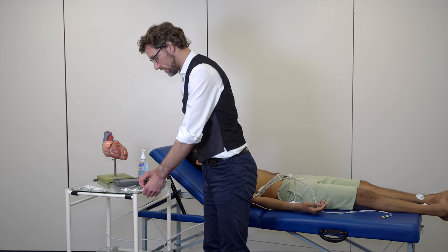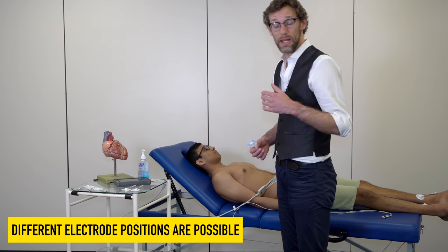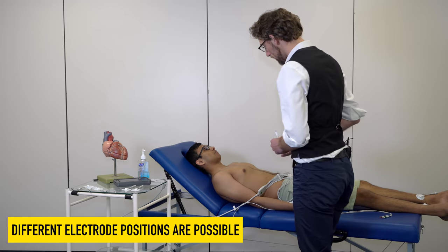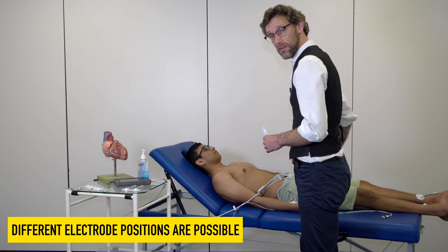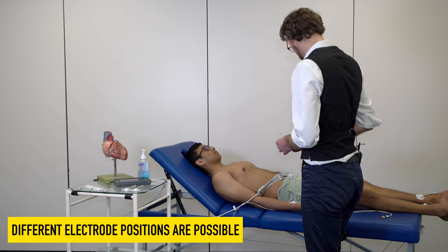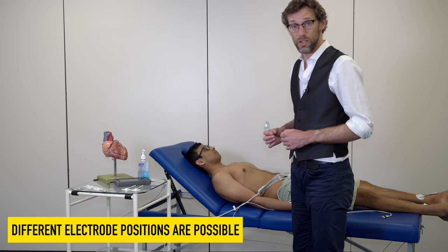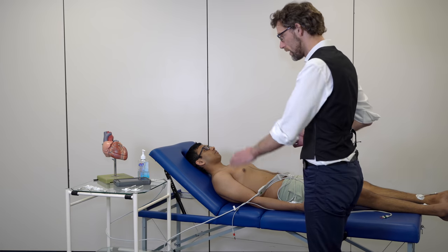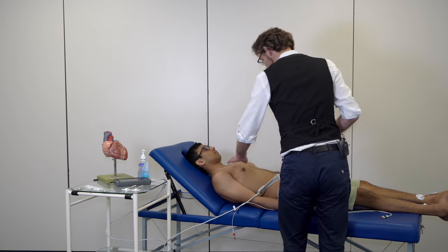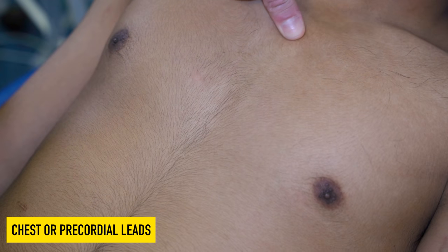You'll see certain ECGs — for example when doing an exercise ECG — where leads are placed on the shoulders and over the mid thighs. This is to reduce the risk of them coming off whilst the patient is running on the treadmill. In terms of the six chest leads, the precordial leads, we need to find the manubriosternal angle.